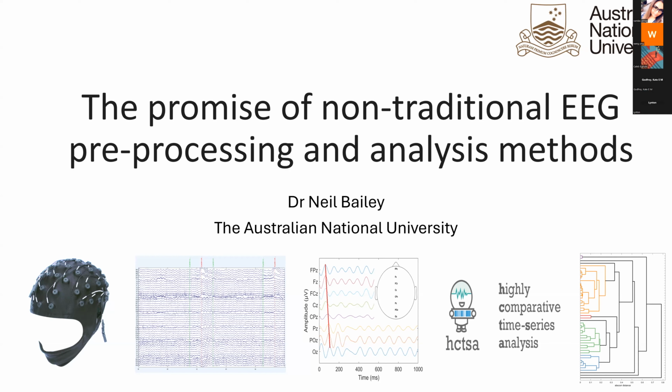My conjecture, which I'll get into in a moment, is that ICA for some electrodes, some analyses, some time windows, can imperfectly separate neural activity from the artifact. And so it does mean that you can reduce the neural signal, and that can specifically occur for one condition and not another. So I'll get into that in a moment.